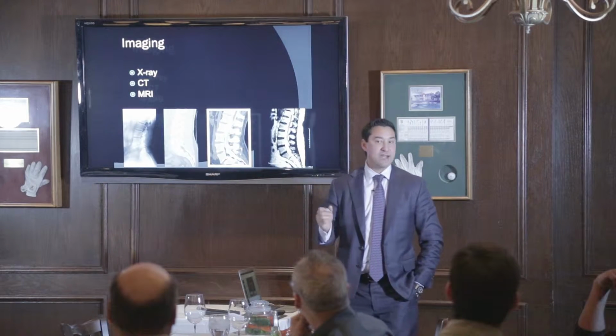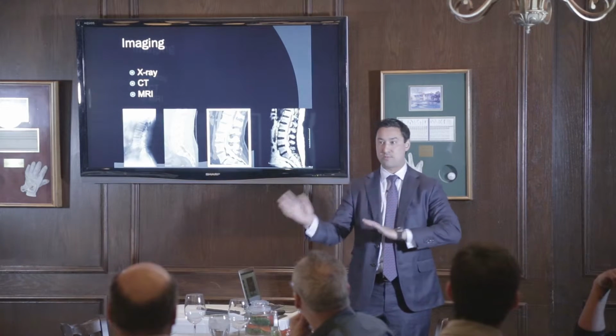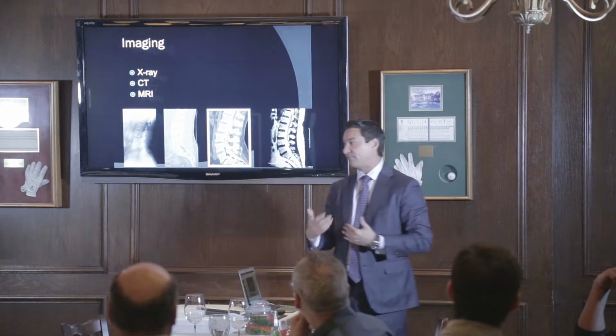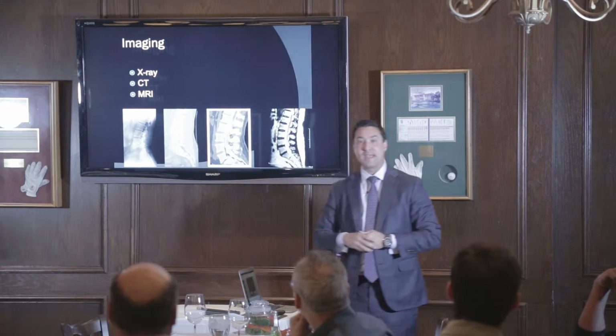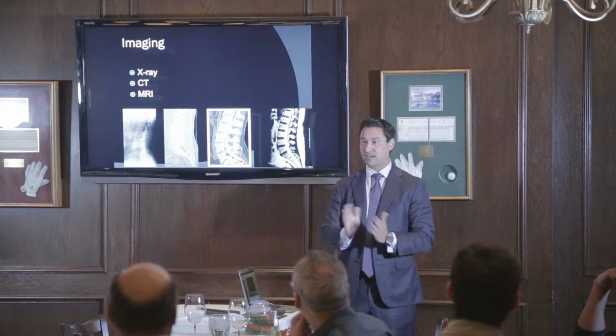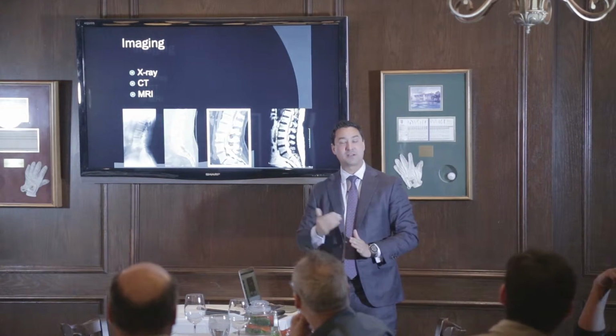So they'll say, I've already had x-rays. You know, the ER did it, the primary care doctor, the chiropractor, they did x-rays. But for me, they have to have flexion extension. So that's really important. And so I train my staff to explain to the patient so they understand why they're getting these special x-rays. So what I'm looking for is instability, spondylolisthesis.